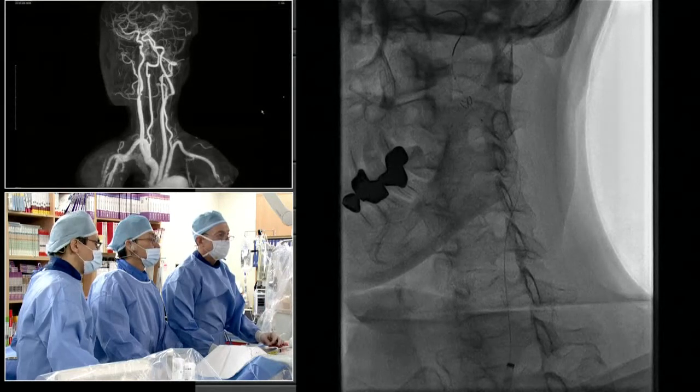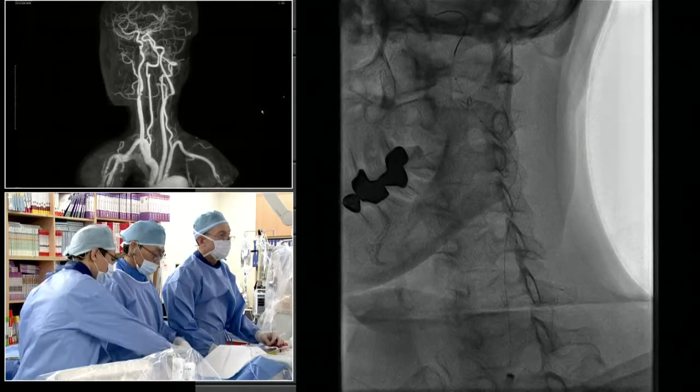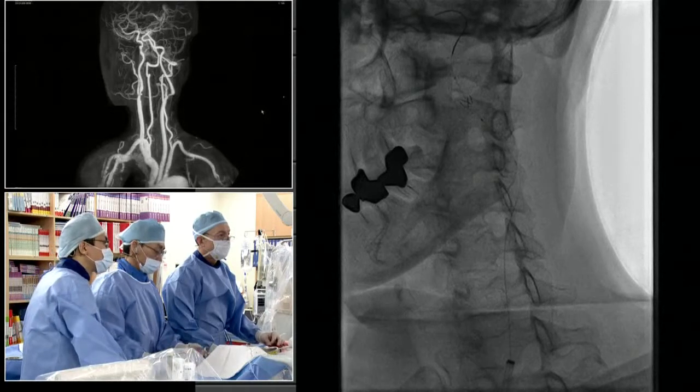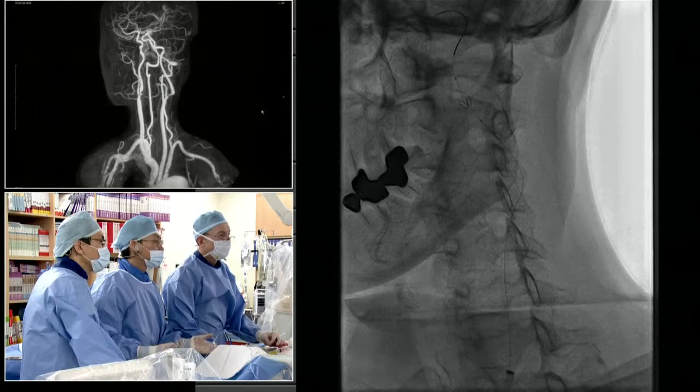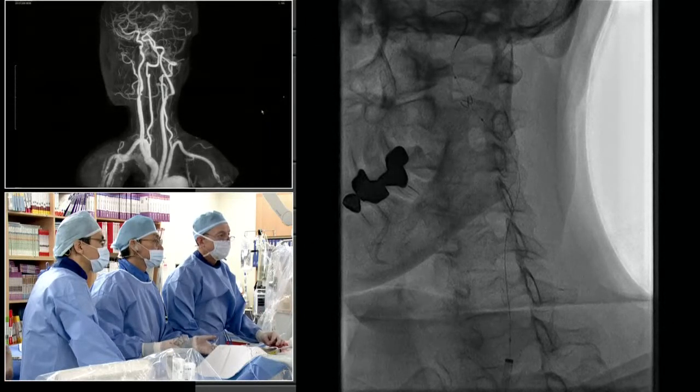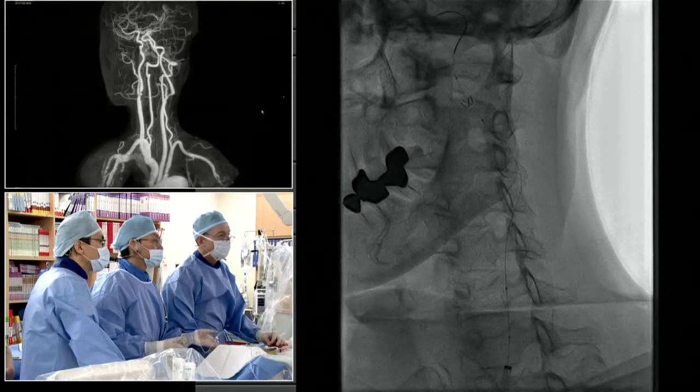I think there are a lot of good choices that are available right now. I like an independent wire, the ability to cross with a wire prior to introducing the filter. So I like the NAV6. We also can use a Spider in that setting.